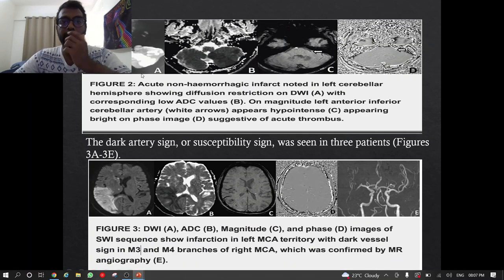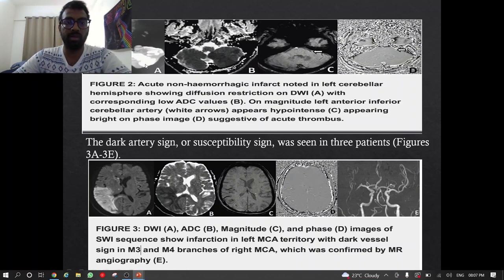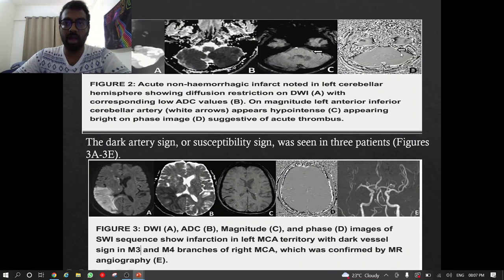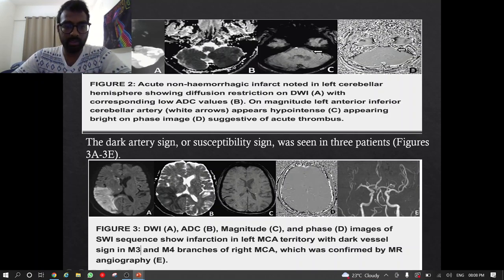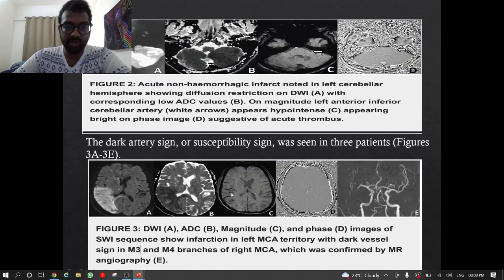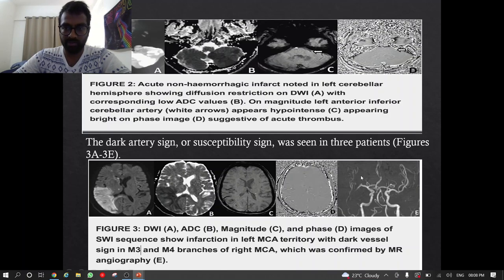In this image, an acute non-hemorrhagic infarct in the left cerebellar hemisphere shows diffusion restriction on DWI with corresponding low ADC values. On the magnitude image, the left anterior inferior cerebellar artery appears hypointense and hyperintense on phase image, suggestive of acute thrombosis. The dark artery sign or susceptibility vessel sign was seen in three patients. SWI shows infarct in the left MCA territory with dark vessel sign in M3 and M4 branches of the right MCA, confirmed by MRA.